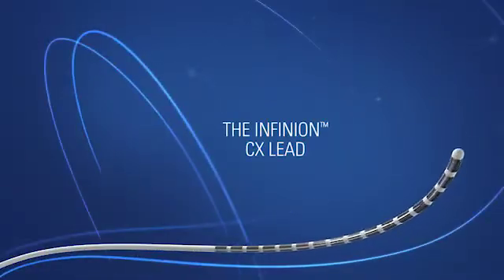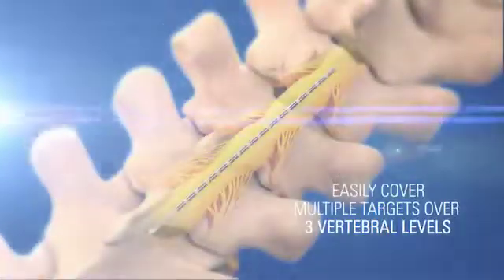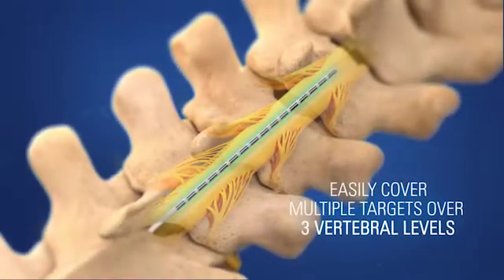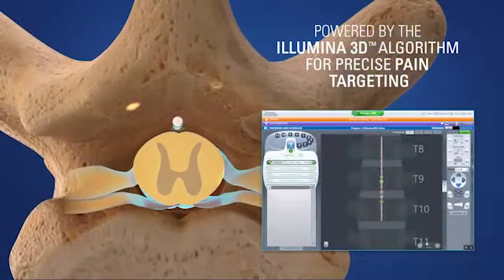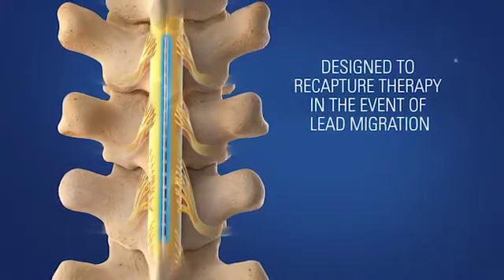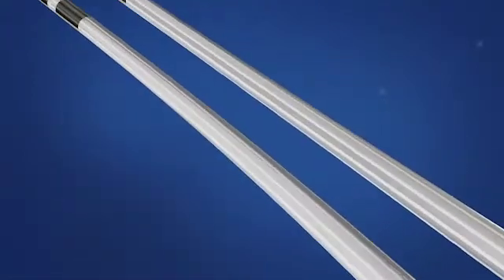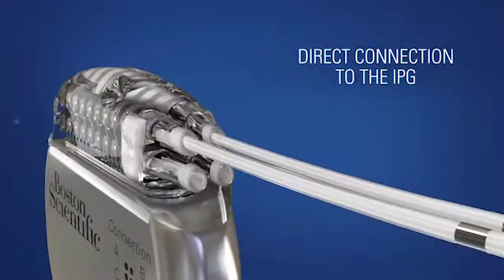Introducing the Infinion CX Lead and the innovative Entrada needle. Easily cover multiple targets over three vertebral levels, powered by the Illumina 3D algorithm for precise pain targeting. Designed to recapture therapy in the event of lead migration. All-in-one design reduces connection points with a direct connection to the IPG.